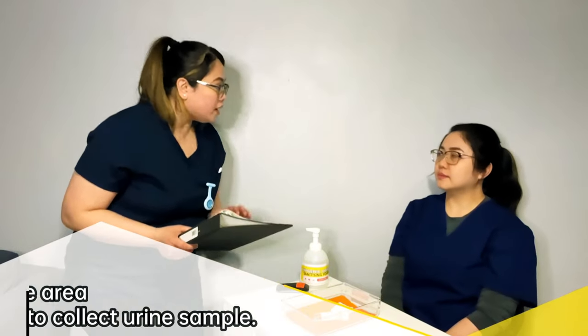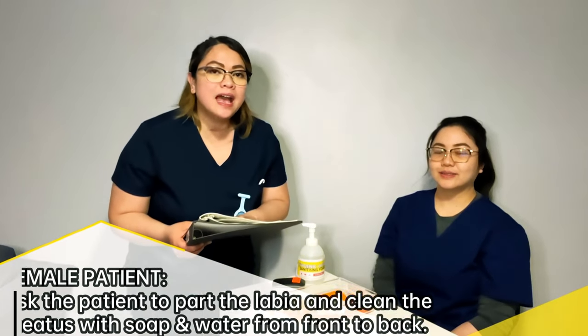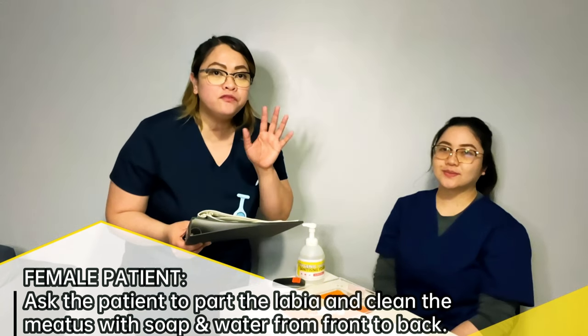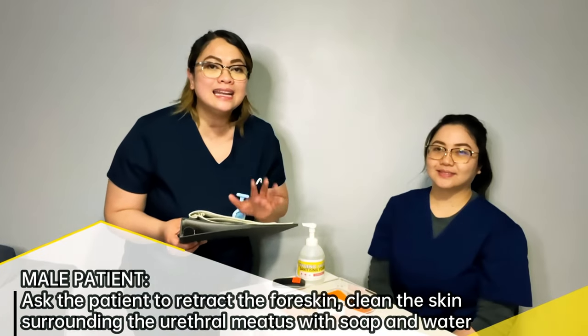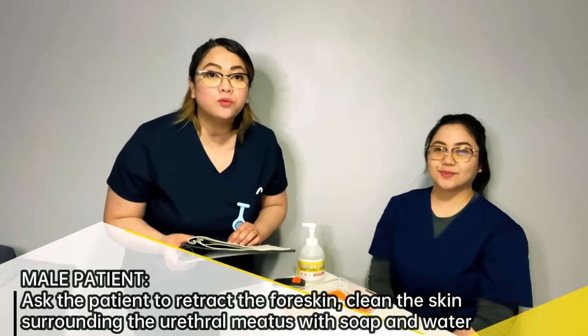You want to do it in the toilet? Yeah. Okay. For the female patient, ask the patient to part the labia and clean the meatus with soap and water. Make sure to tell them from front to back. If you have a male patient, ask the patient to retract the foreskin and clean the skin surrounding the urethral meatus with soap and water.